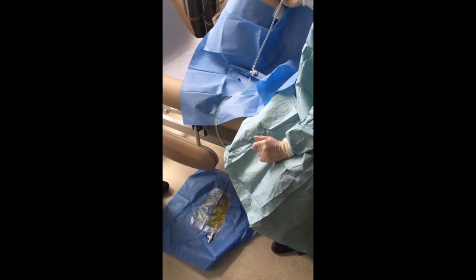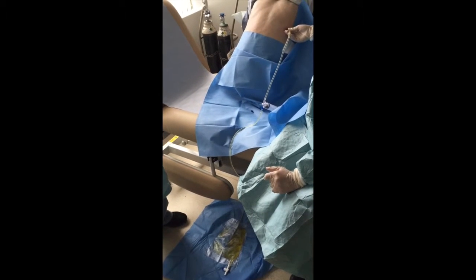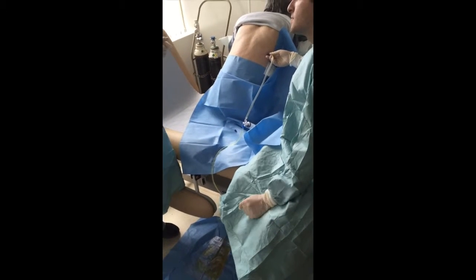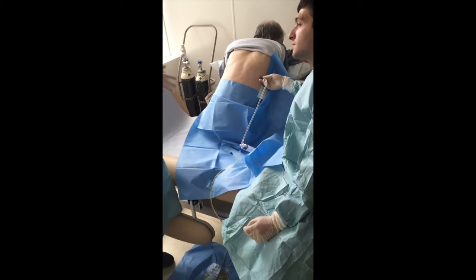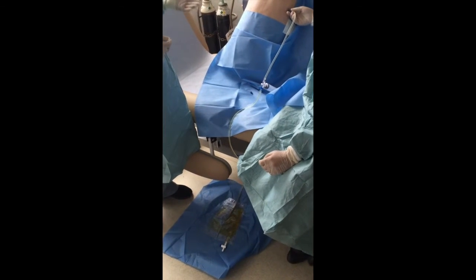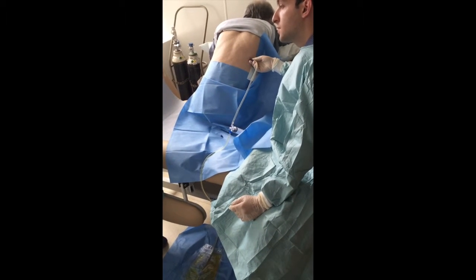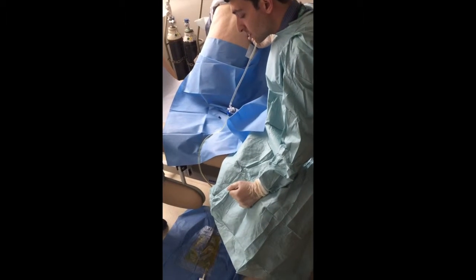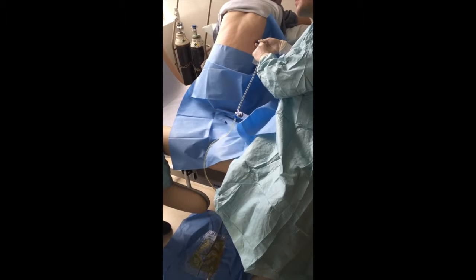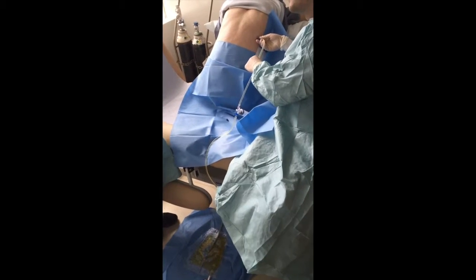And what we're going to do is drain about 1 litre off because it's a diagnostic therapeutic pleural procedure. And the reason we're not going to take the whole lot off is because if we have inconclusive pleural cytology, then we're going to probably think about a medical pleuroscopy or possibly an indwelling pleural catheter with somebody with a poor performance status and a known malignant effusion. But at the moment, we don't know what the cause of this effusion is, so this is just part of the diagnostic pathway.